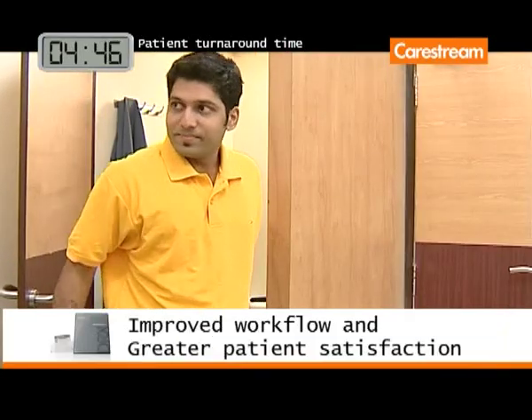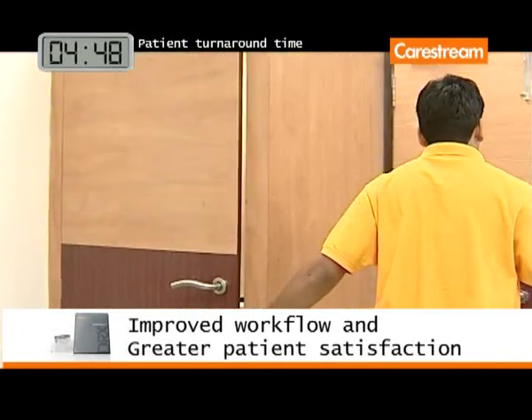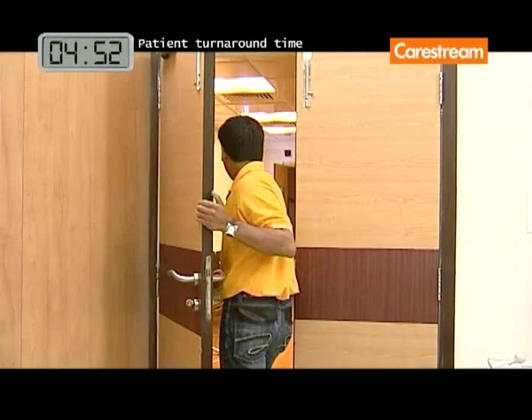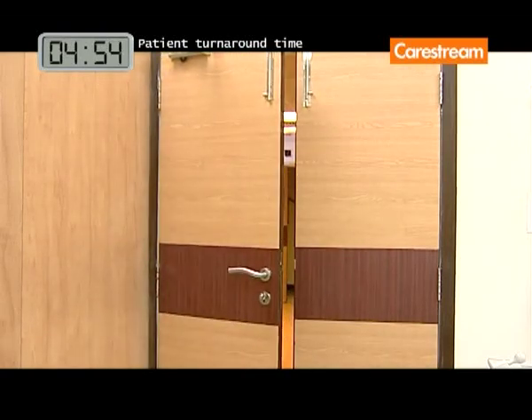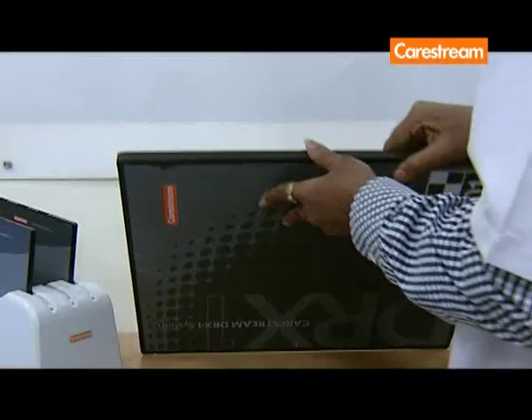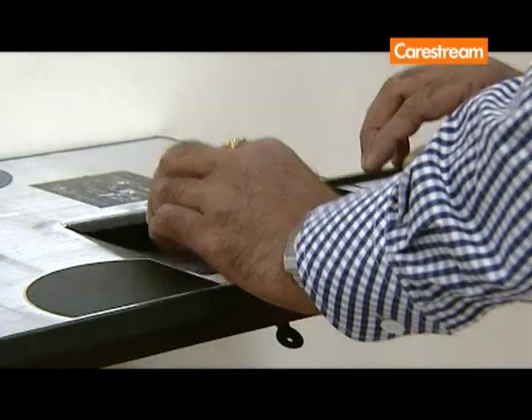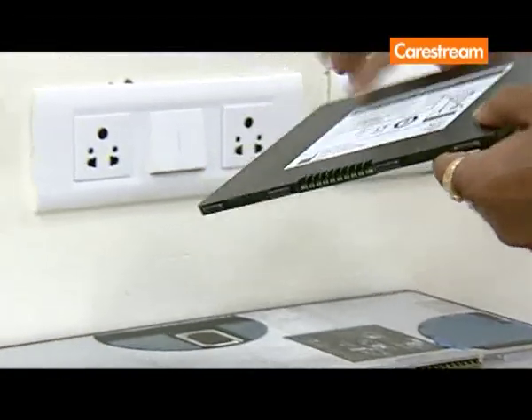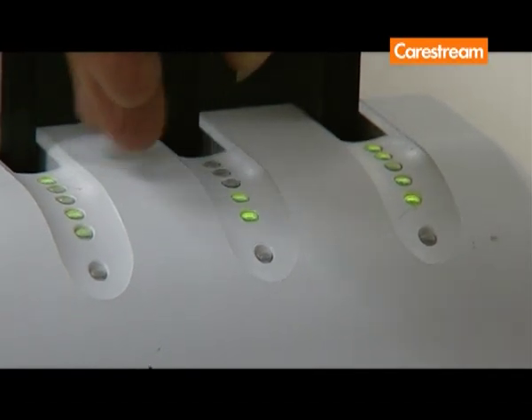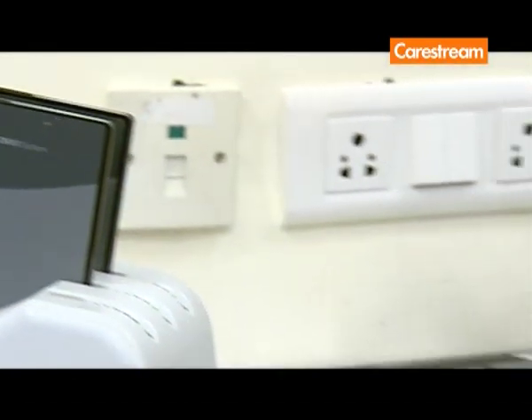As you can see, with the CareStream DRX-1 system, the patient turnaround time for X-ray examination shows a marked decrease. The DRX-1 system battery charger simultaneously recharges up to 3 DRX-1 system batteries to provide an uninterrupted workflow.